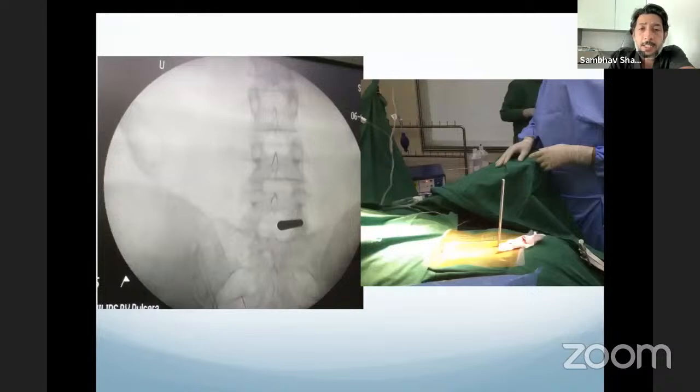Once we've taken the incision, we dock the working dilator. And with the dilator, I think this is a very important instrument, as it guides you exactly where you want to dock.